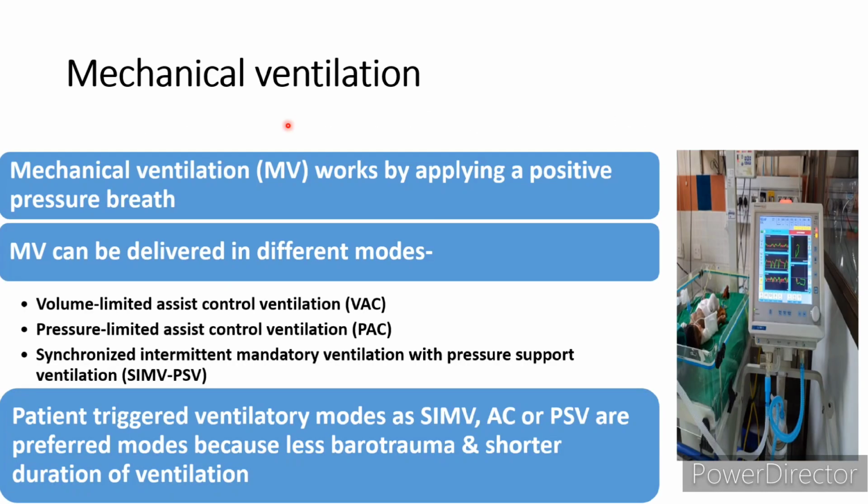Now the mechanical ventilation. Whenever the patient is having respiratory failure, severe respiratory distress, and not maintaining the target saturation with other oxygen delivery devices, then we have to use mechanical ventilation. It works by applying positive pressure breaths.